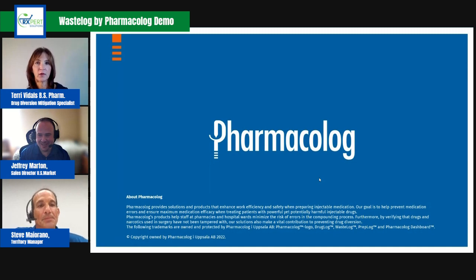So formulary wise, you said the person can enter amounts, and it goes down to the really small amounts for pediatrics. You haven't had any trouble reading any pediatric concentrations? No, not so far, whatsoever. Okay. And who maintains the machine? I'm assuming it has to be cleaned or maintained in some way. Do you train the staff on site to take care of that?